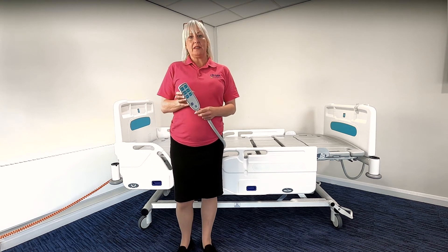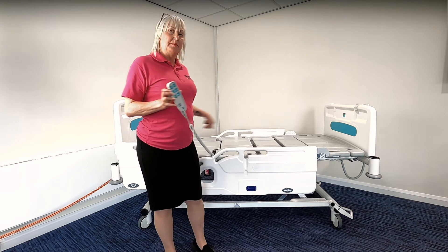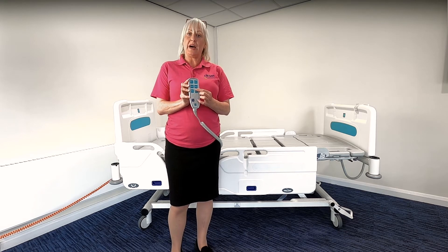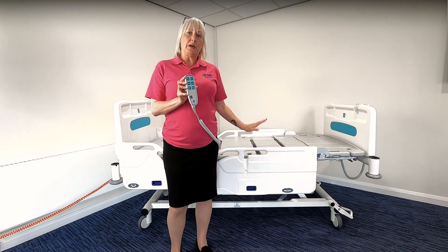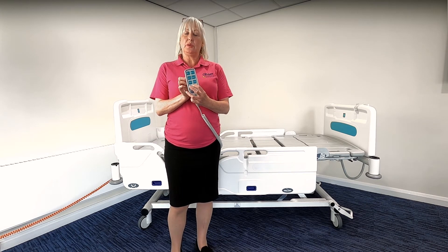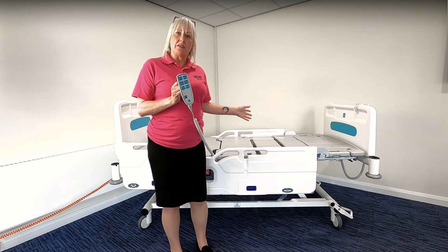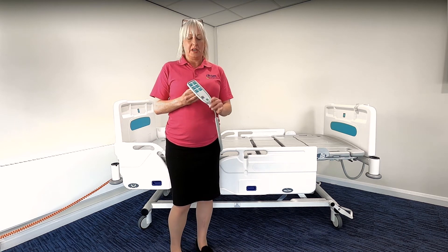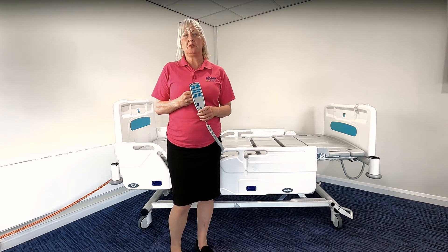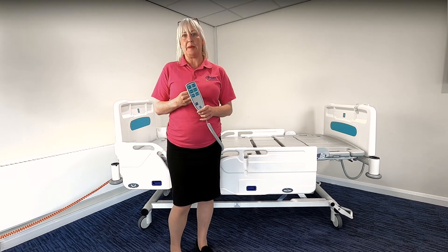On the patient handset, the person in bed is able to raise and lower the head of bed with the buttons at the top, is able to raise and lower the platform height down to 42 centimetres only, and they also have the ability to put the auto contour function on, which raises the head of bed and knee break together for their own comfort. In addition, on the patient handset you also have an under-bed light which is really useful for darkened environments and to see any obstacles that may be around the bed space.